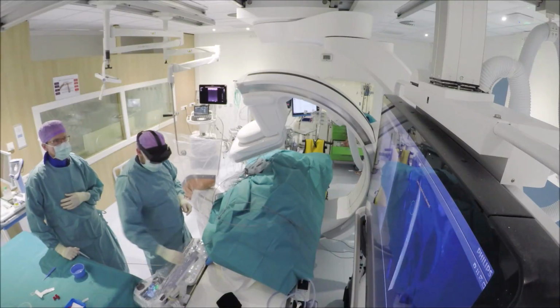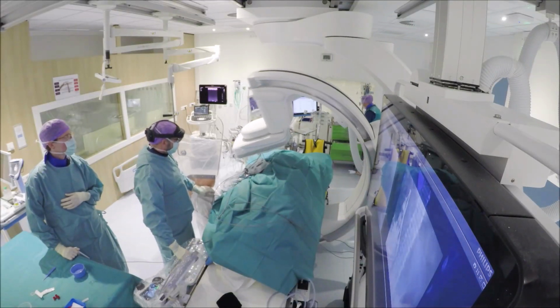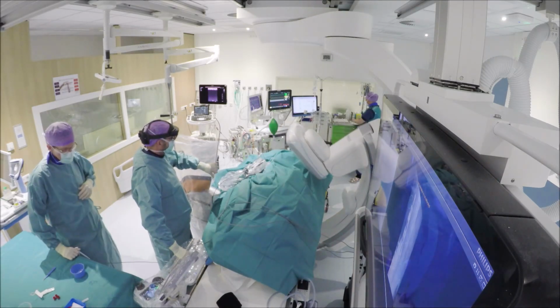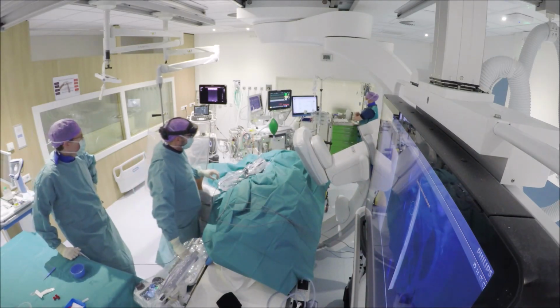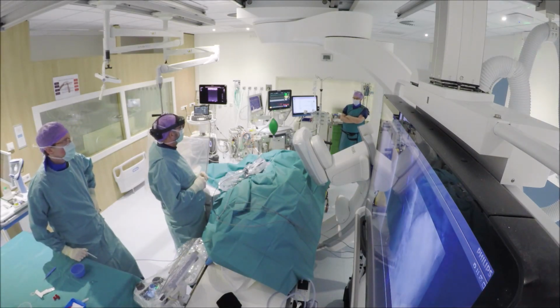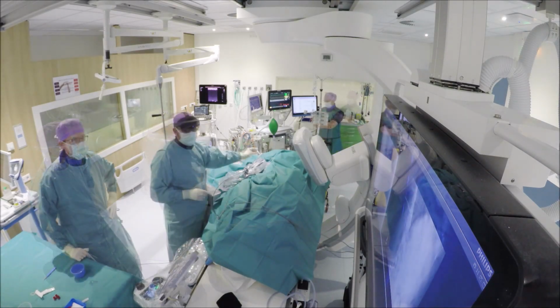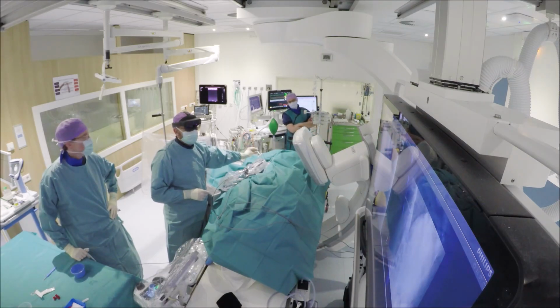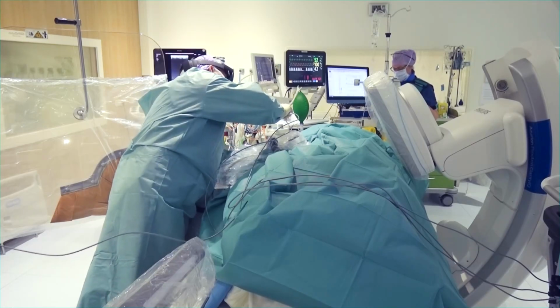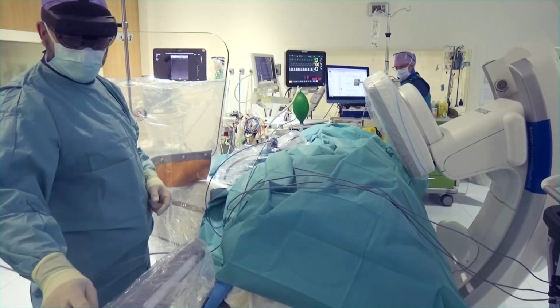And for monitoring the progression of the needle along the needle path, the C-arm is then again moved to the 90 degrees perpendicular progression view position. Our third needle is placed exactly the same way as the previous two.